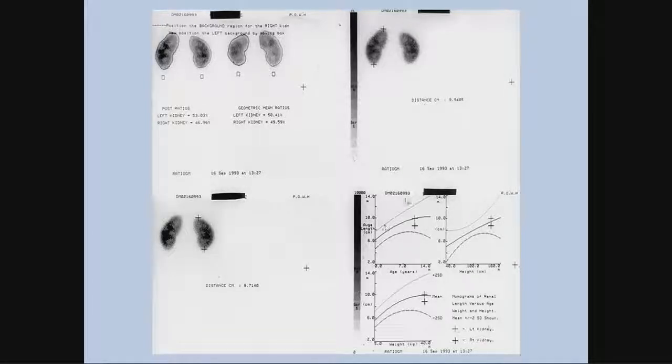we've devised a nomogram here of normal renal lengths. Most of our kids that are scanned are young, so the standard deviation is tight in the young age and it's not so accurate in the older age. And if you compare the nomogram on DMSA to the nomogram on ultrasound, in general in nuclear medicine we measure about 0.5 to 1 centimetre longer than on ultrasound, and there are two reasons for that.